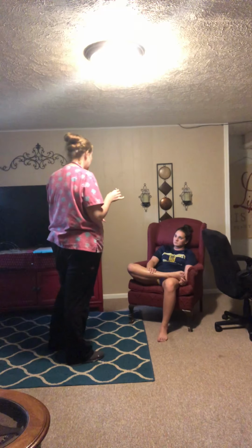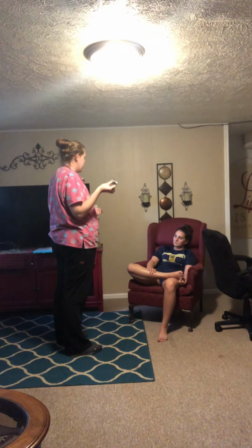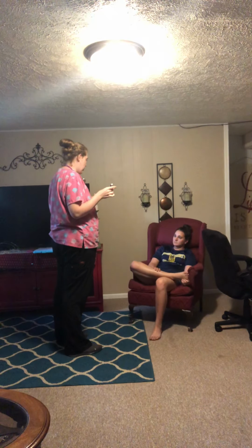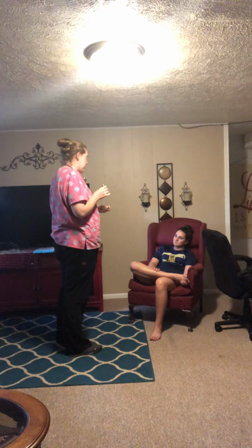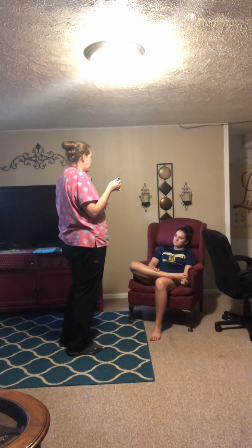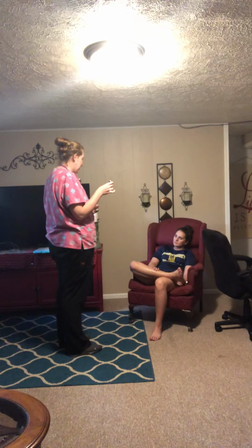So to use one of these devices, it's called a metered dose inhaler. We're going to shake it up really well. Okay, and then if it's been a while since you've taken it, you just need to take the lid off here and discharge one dose into the air. That way you know you're getting the full dose. So when you're ready, you go ahead and shake it up, take the mouthpiece off, you'll wrap your lips securely around the mouthpiece, and then you're going to simultaneously push on the canister and inhale deeply, hold for 10 seconds, and then you can exhale.